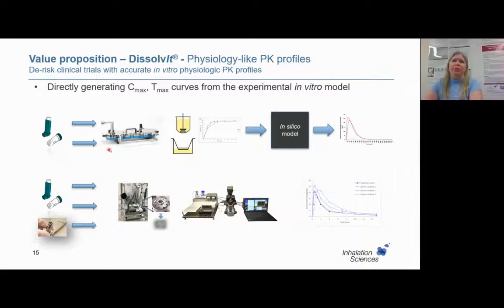Other methods might use an NGI, for example, to deposit the material. And we use PreciseInhale together with this holding chamber, and we deposit the material on glass cover slips. And in the middle, you see an evenly deposited aerosol. You could compare that to an NGI deposition where you have those nozzle patterns, which will influence the dissolution of the particles. We have shown that in a publication.